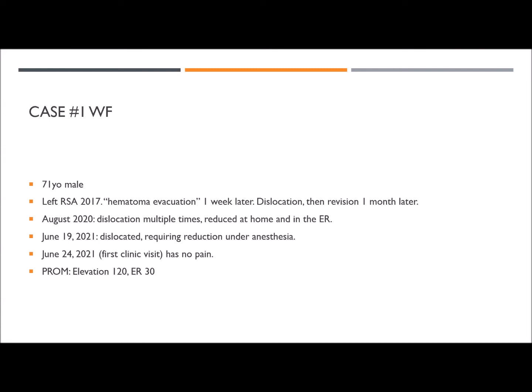It's interesting that the cartoon graphic of those plates shows an onlay humerus. That's the construct I was doing for a while, and I felt like I did have a lot more acromion fractures, which is what made me switch to an inlay humerus and some lateralization on the glenoid, and less distalization of the glenoid. So now for me, the sphere ends up pretty much at the bottom of the glenoid instead of inferior overhang. So anyway, I've gone through a lot of that same thought process.